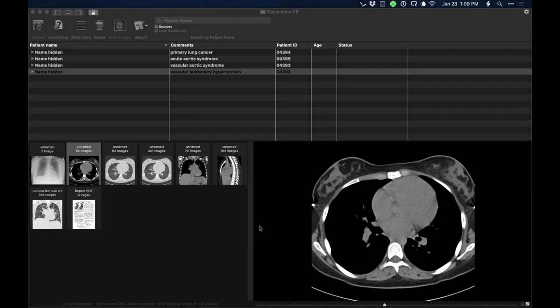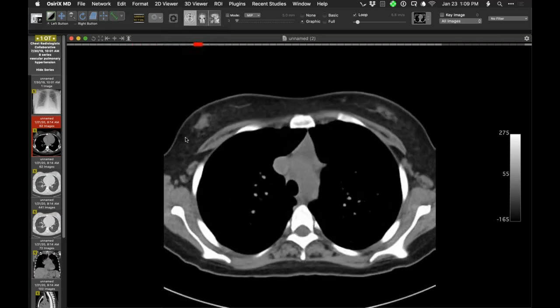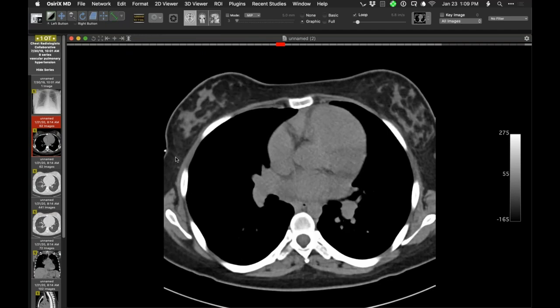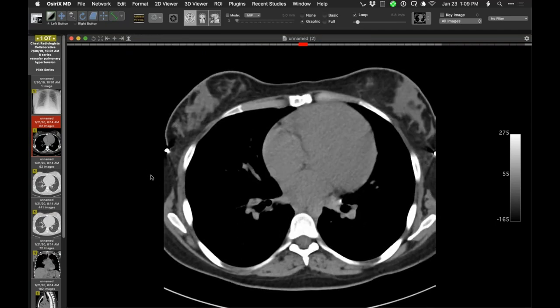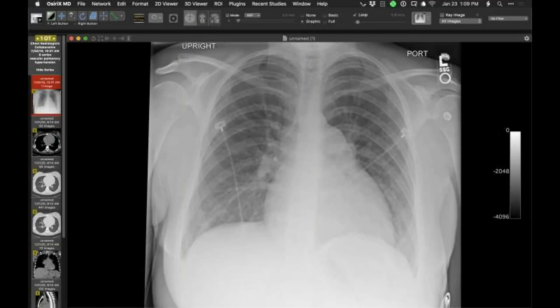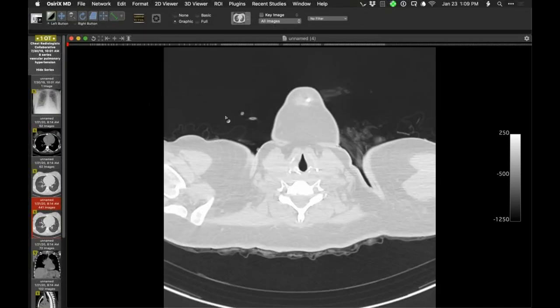This is a patient that we currently have who's being worked up for transplantation in the context of very severe pulmonary hypertension. This is idiopathic pulmonary hypertension. Right off, you can see on the radiograph the degree of pulmonary artery dilation and enlargement of the right atrium and right ventricle. This is a non-enhanced CT that I'll show you next.